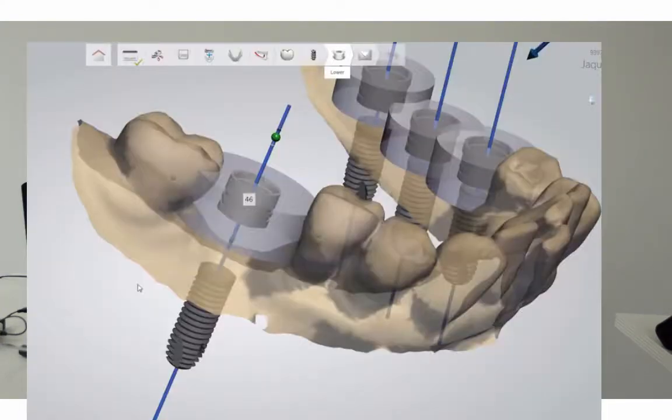Another module available to you from ThreeShape is our implant studio. The implant studio allows you the opportunity to not only do implant planning, but design surgical guides as well. Trios captures the implant position and soft tissue emergence. This will help you save time by skipping steps that are cumbersome and error-prone. With more detailed information, you will have a better fit for you and your patient.